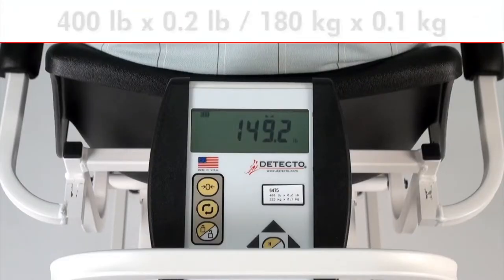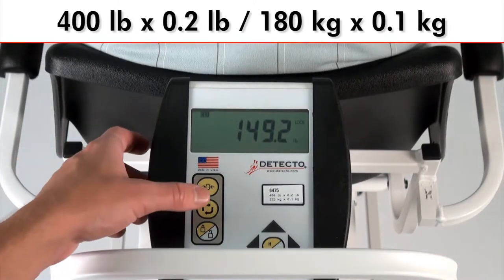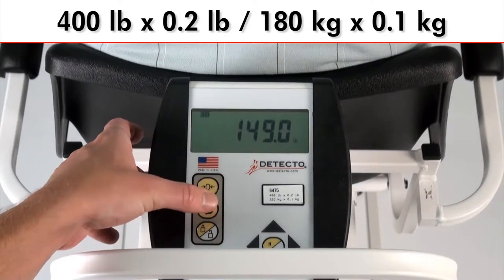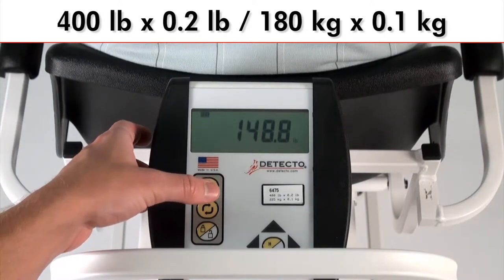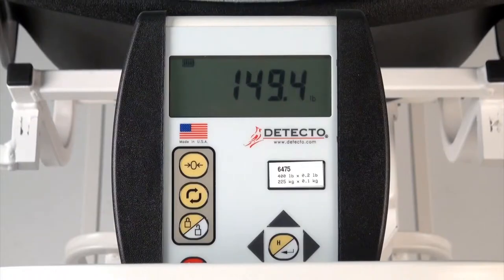The 6475 features a 400 lb by 0.2 lb and 180 kg by 0.1 kg capacity. You may easily switch between imperial and metric readings by pressing the units key. The 3/4 inch high LCD displays large bold readouts and also provides body mass index calculation.